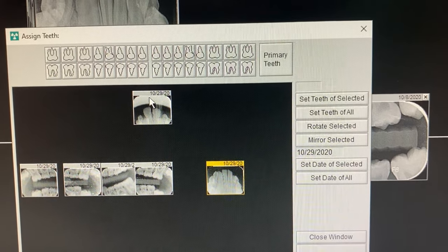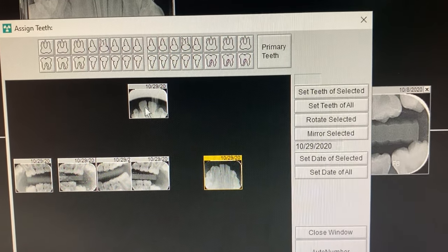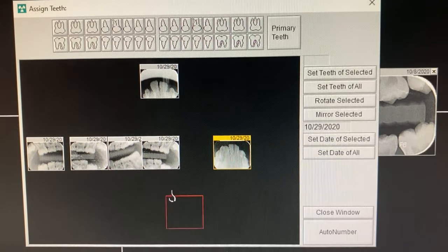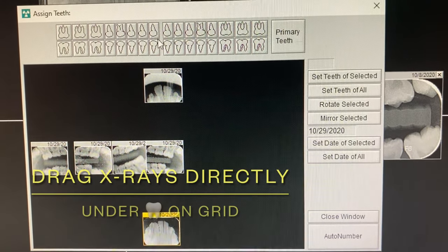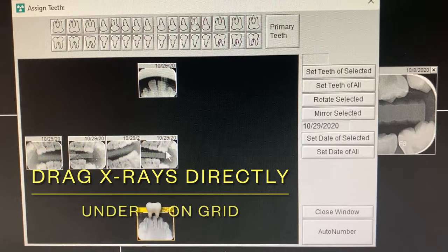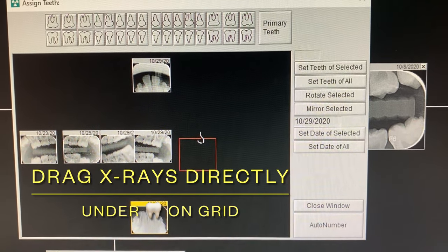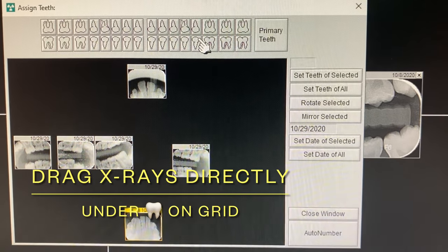When putting these X-rays on the grid, make sure they're lined up exactly underneath that tooth charting. That's an upper PA. For the lower PA, see it's perfectly lined up here. For a bitewing, this patient has primary molars and a first molar, so I lined it up underneath the primary first molar area.